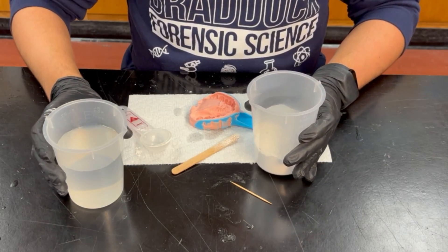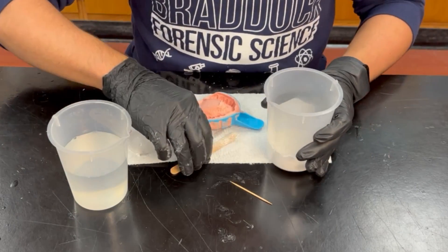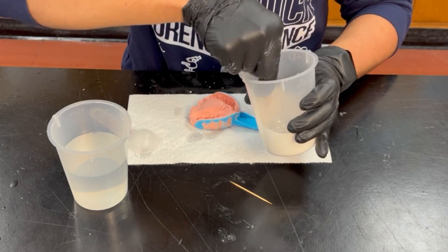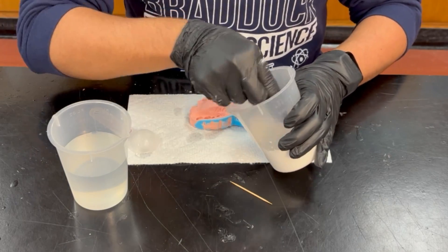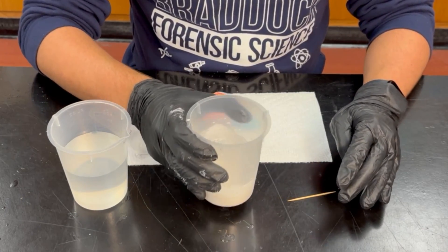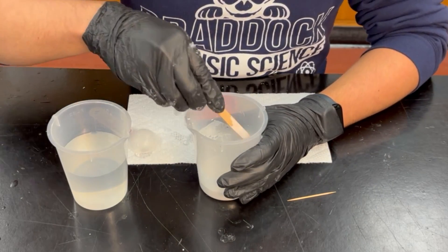Now you will add equal parts of water and mix. Once done integrating the water and the plaster of Paris, hit the container against the table to get rid of all the bubbles that are trapped inside the material. Unfortunately, we do not have an orbital shaker.